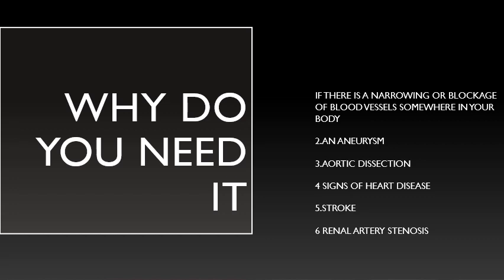So why do we need it? Why do you need an MRA? An MRA is used if there is any narrowing or blockage of any blood vessels in any part of your body. If your healthcare provider believes that you may have a narrowing or blockage of blood vessels anywhere in your body, they may recommend an MRA.